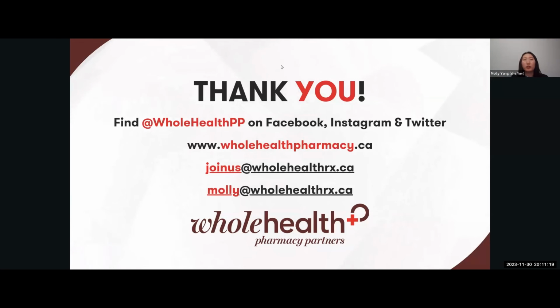Unfortunately, right now the real-time feature is only available on the app because it was an app update. The sensor itself is still the same between those using the reader and the app. So if patients are still using the reader, it's still scanned, so the message to them would be to remind them to scan at least every 8 hours so you can get the full data. And I put the link in the chat for evaluation. If anyone has additional questions, feel free to put them in the Q&A and we'll get to them.